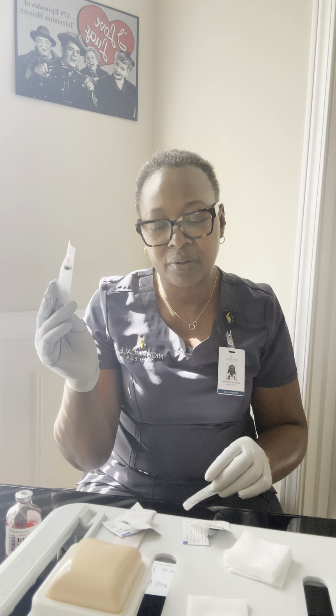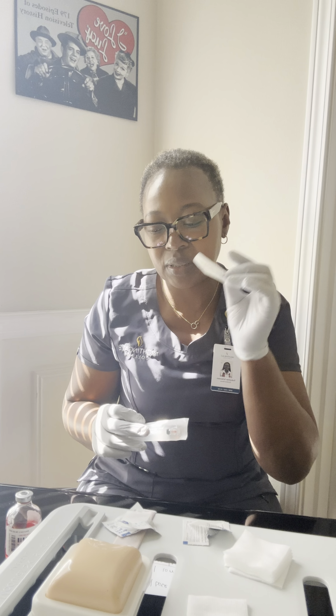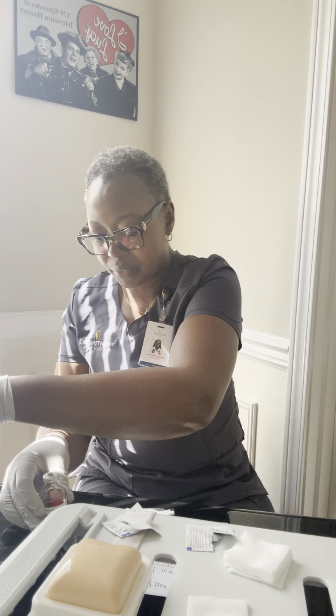The order says 1,000 units per dose, and what I have at hand is 10,000 units per 10 ml. So when I do my calculation, I'll be giving 1 ml. I have a 1 to 3 ml syringe, and I have a 25 gauge needle. So I'll go ahead and first prepare my medication by first cleaning the cap for 25 seconds.